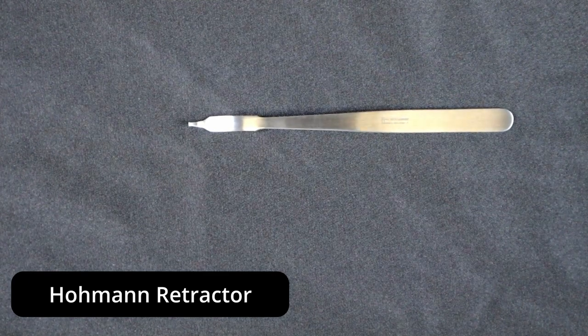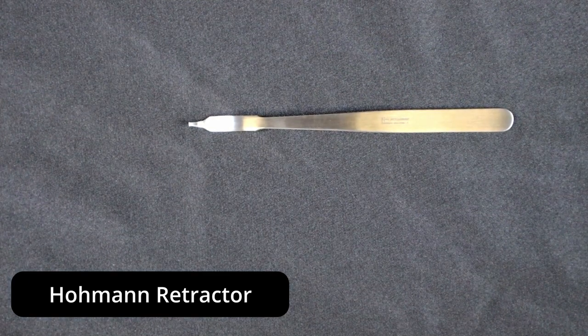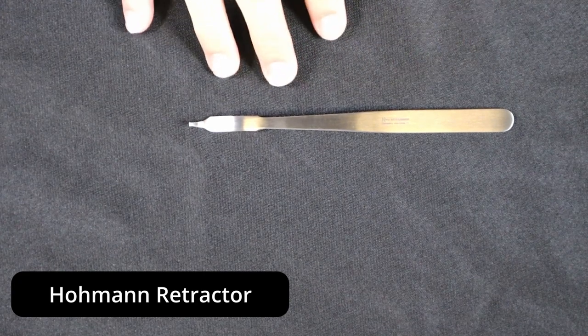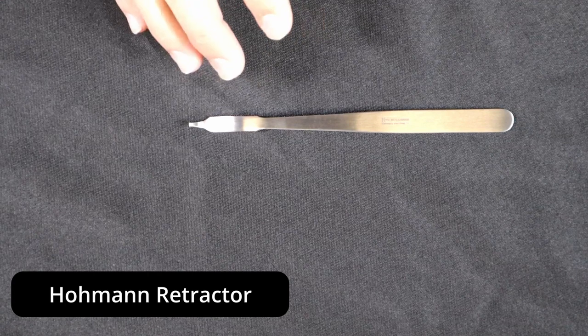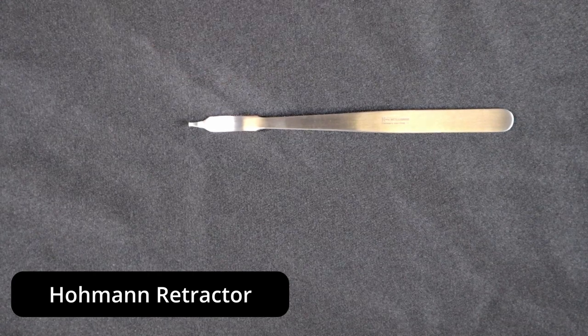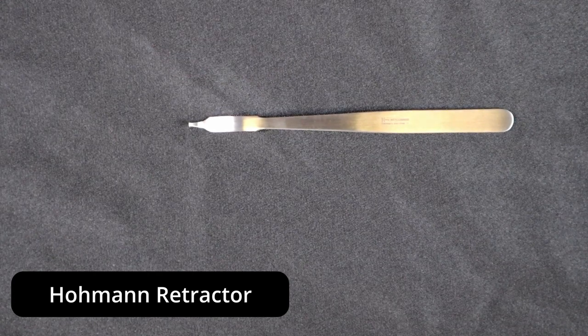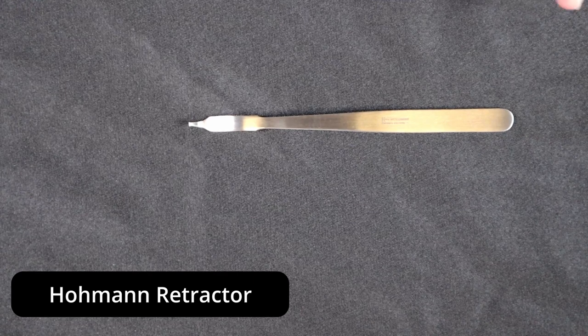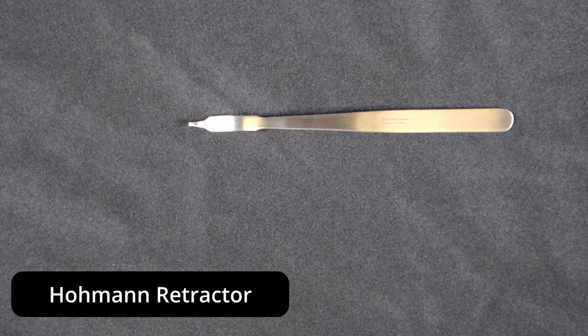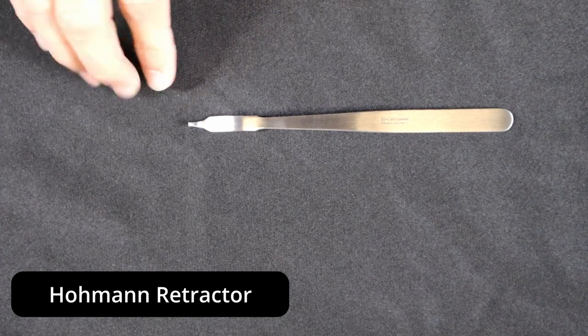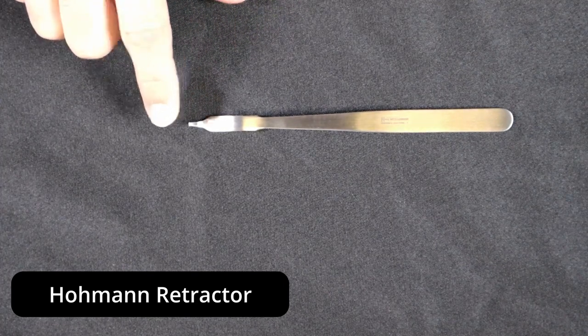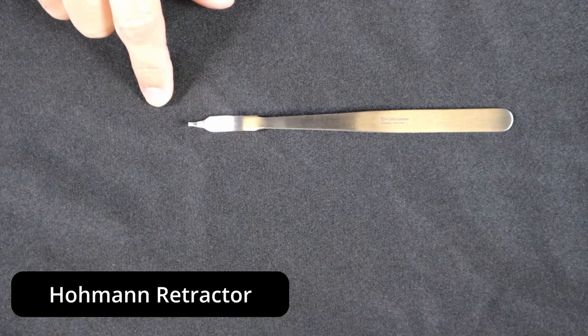Typically when you're assembling Hohmann retractors, especially these smaller versions, you'll see these go into paper sterilization bags often, or gather together in the bottom of a tray. Keep in mind that anytime you can do things to protect these distal tips, you're going to want to try to do it.